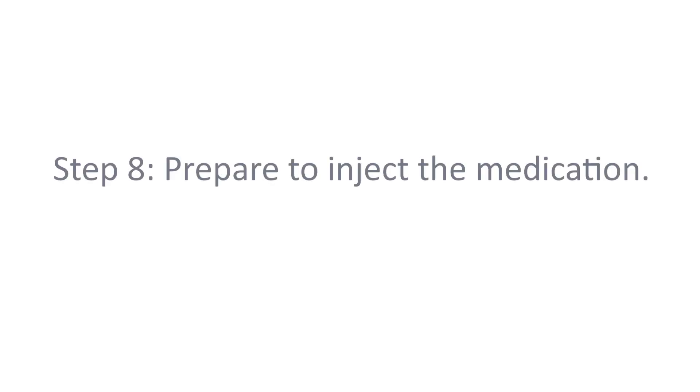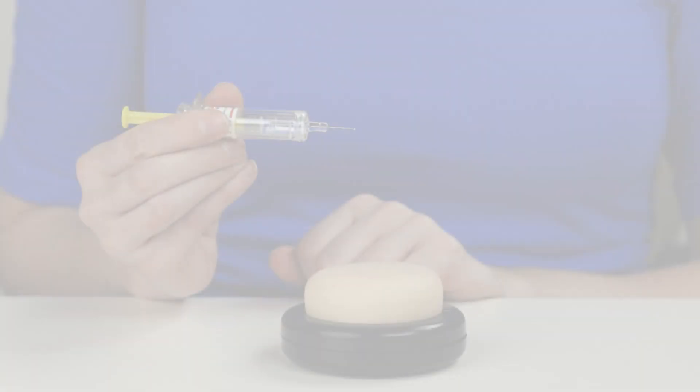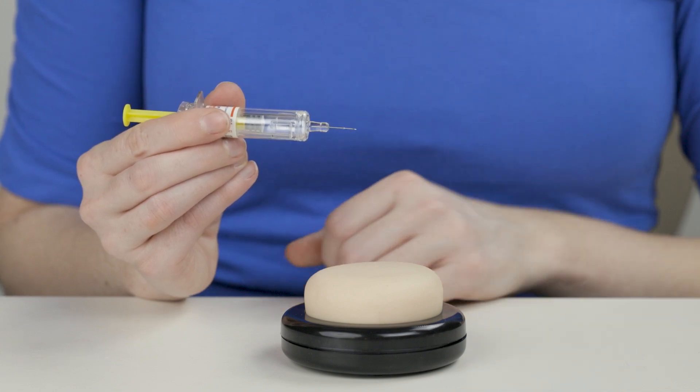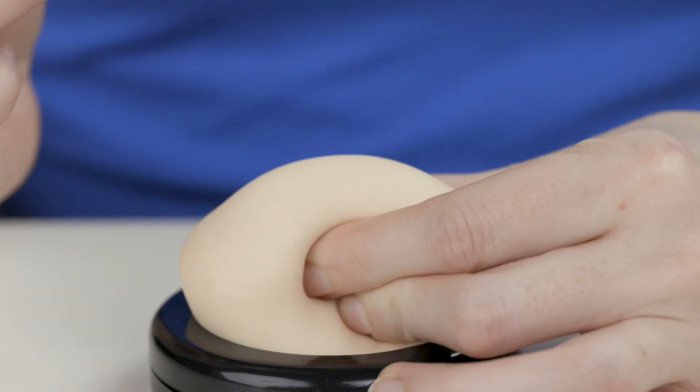Step 8: Prepare to inject the medication. Make sure you're still holding the syringe around the middle like a pen or dart. With your other hand, gently pinch two to three inches of skin and fat tissue.